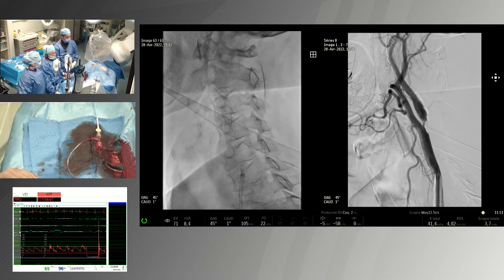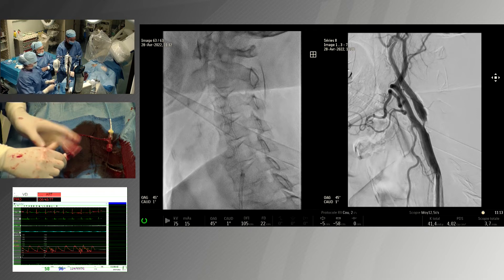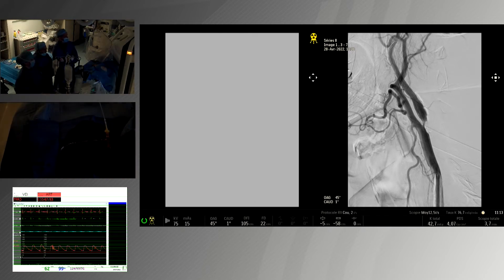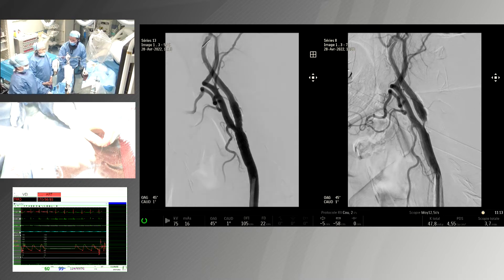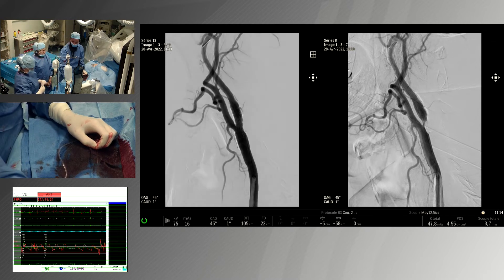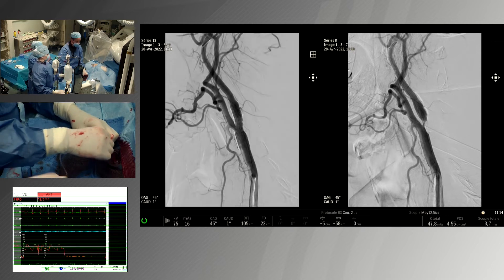It is a very calcified, diseased artery. We have injected atropine and ephedrine again, and we wait for the pressure to stabilize before checking. The result is very good. You can see the small ulceration at the entrance of the stenosis is now very slow — I think we have excluded that ulceration. The external carotid is also okay.